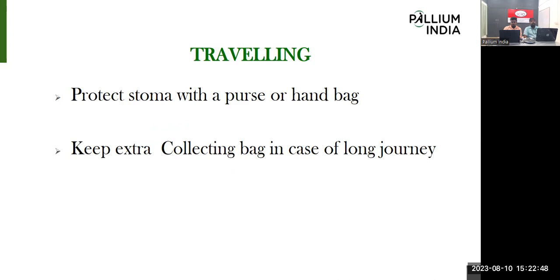Because their food pattern will vary in between, according to the food pattern variation there may be a chance of diarrhea, or the bowel volume may be more. So they need to carry extra bags during the journey.